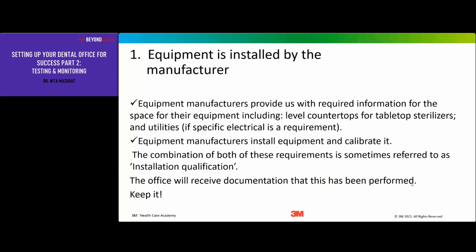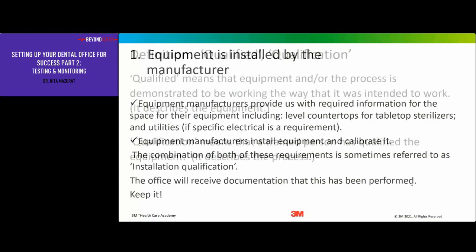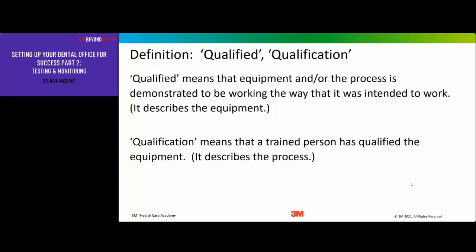Your office will receive documentation that this has been performed. Do not throw that out. You keep that, and you keep it forever.